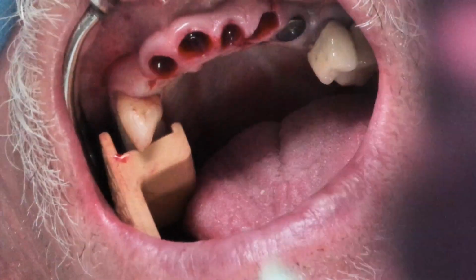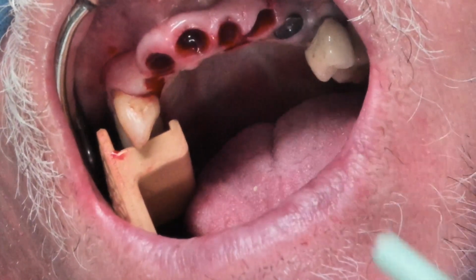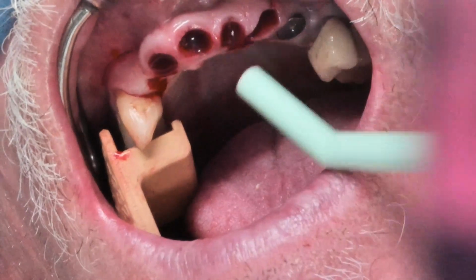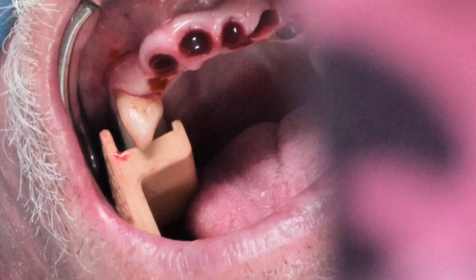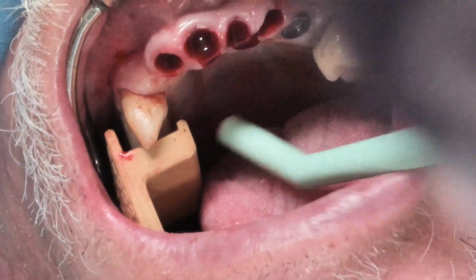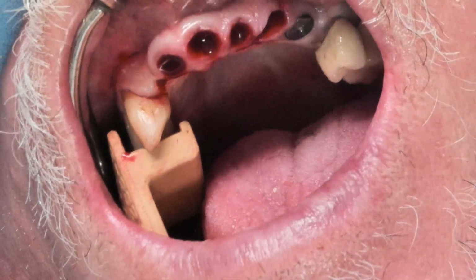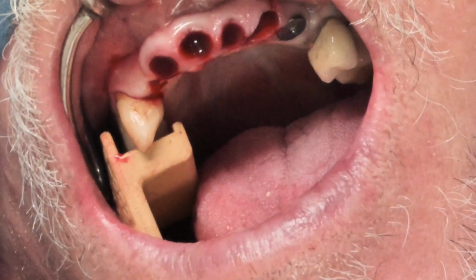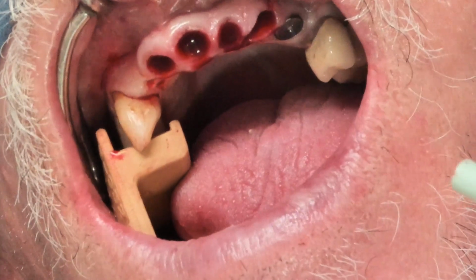Can you bring the burs to me, please, Nicole? We're going to start to think about constantly creating an aesthetic emergence profile in the tissue. And building this development here is critical to the overall success of the case. Nicole, let me go back to the other guide with my temp stent, the one that I've already held out, because I'm not going to do this now. Thank you. Okay.